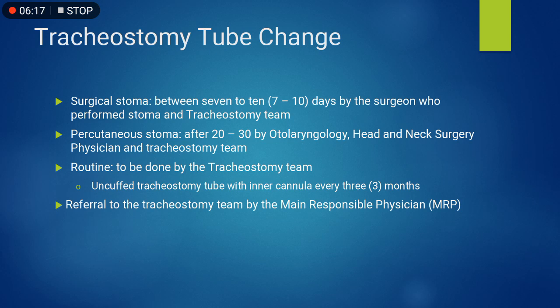The routine change is to be done by the tracheostomy team. Uncuffed tracheostomy tube with inner cannula every 3 months. Referral to the tracheostomy team to be done by our main responsible physician. So that is how we care for patients with a tracheostomy tube.